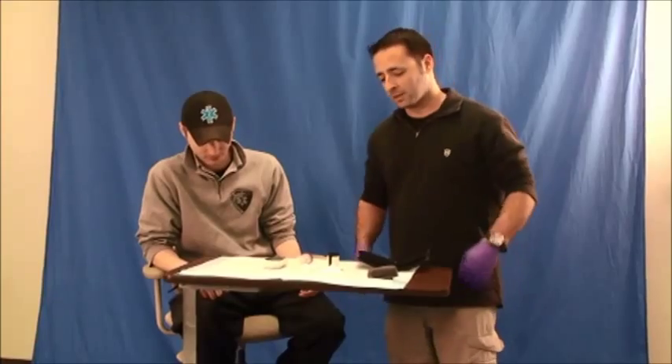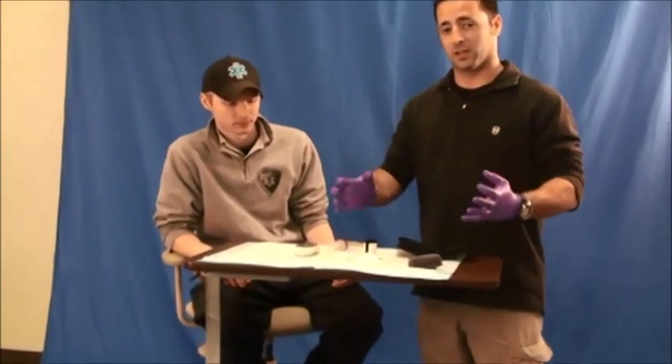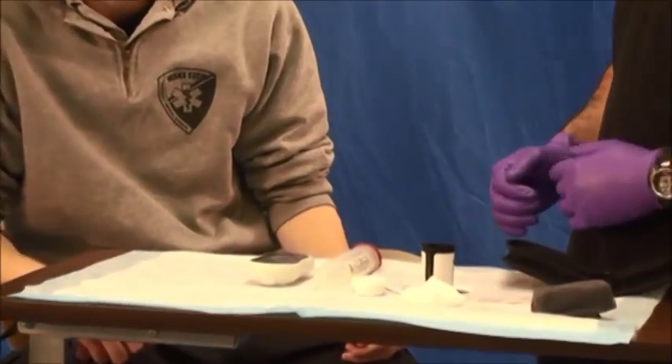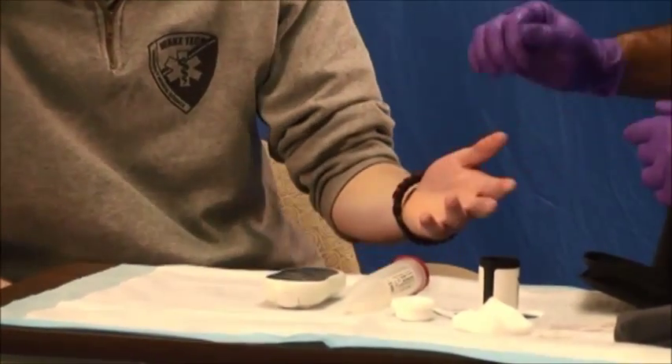How to assess your patient's blood sugar. First, ensure that you have your PPE on. Next, explain to your patient: 'I'm going to check your blood sugar. Which finger would you like for me to use?'